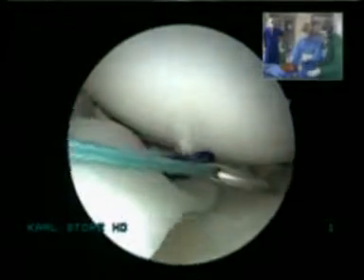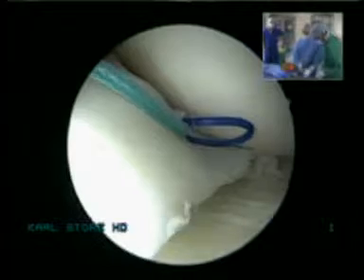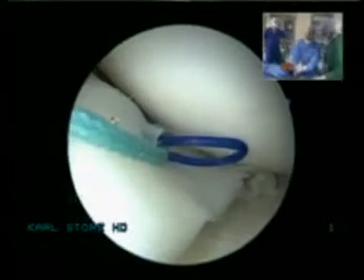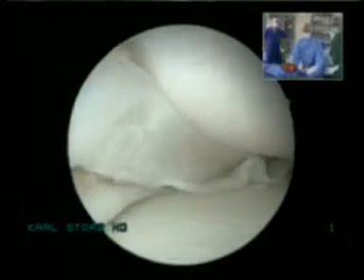Can you pull the needle back? What is this needle that you are using, Dr. Peterson? Is this a standard hypodermic needle? It's a standard needle. Someone must help me. What kind of needle is this? What size? I don't know. It's an 18 gauge. Okay, the standard 18 gauge. It was a big one.